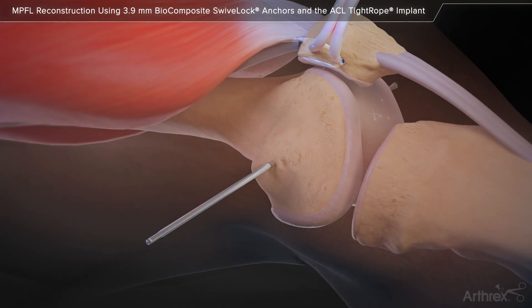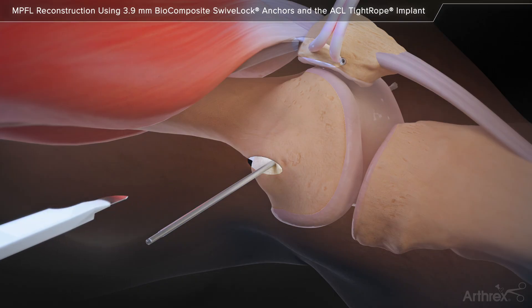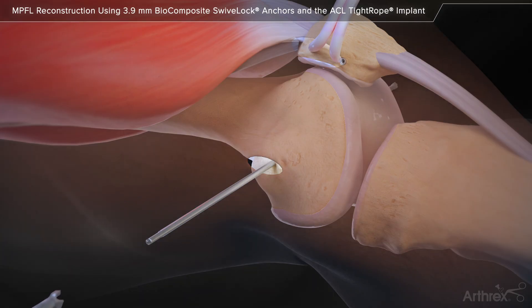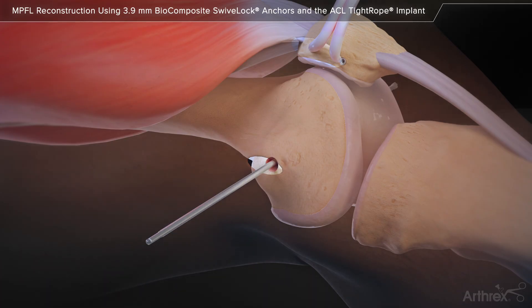Identify the space between the vastus medialis and the capsule and bluntly dissect towards the femoral insertion area with a scissor, leaving the capsule intact. A 1 cm longitudinal incision is made at the level of the 4.0 mm spade tip guide pin. The 6 mm low profile reamer is then used to create a socket extending to the far cortex.